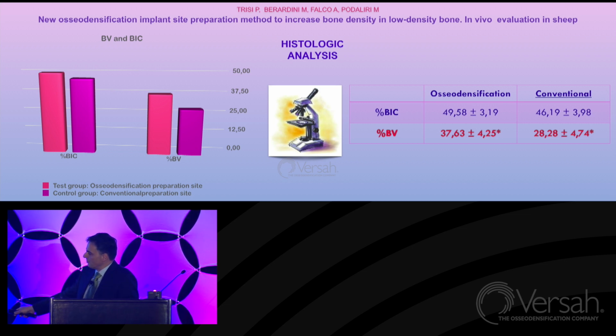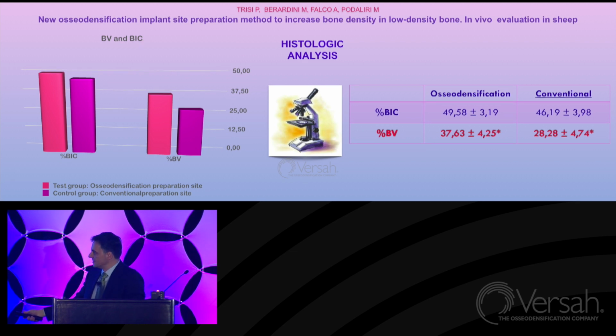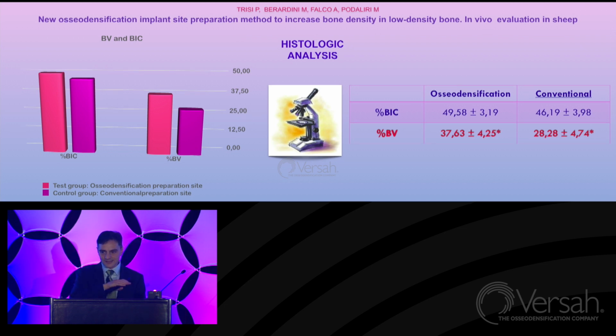If you look at the amount of bone, which is not only in the thread, we measured the bone 1 millimeter from the implant surface, the density within 1 millimeter from the implant surface to the surrounding bone. And we compared the density between the densification burs and the conventional one. You can see that in densification it is 37, conventional is 28. This is exactly what we saw in the histology from Professor Coelho this morning, exactly the same. You see an increase of the bone surrounding the implant. And this increase is not only after placement, which you see after placement. It stays there after healing, 2 months.